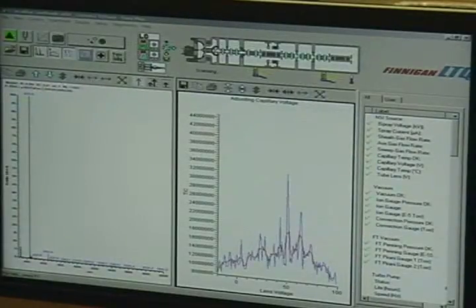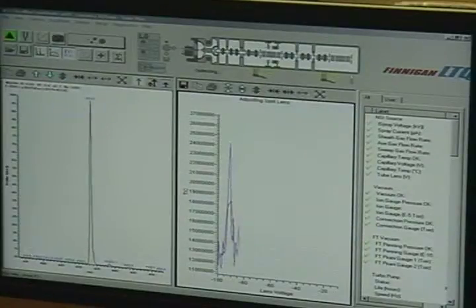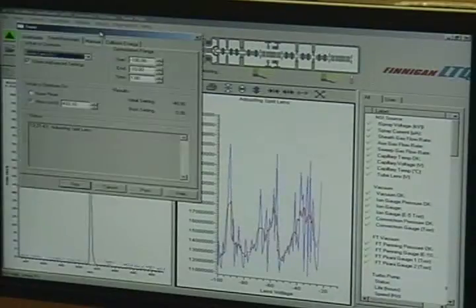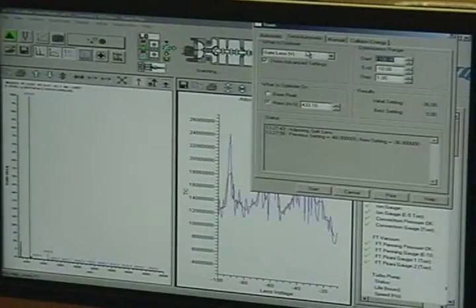Okay. Slightly above the range. Yeah, just slightly above. And do your split gate, your gate lens. Yep, hit start and see what it looks like. So accept that and extend your range on each side.